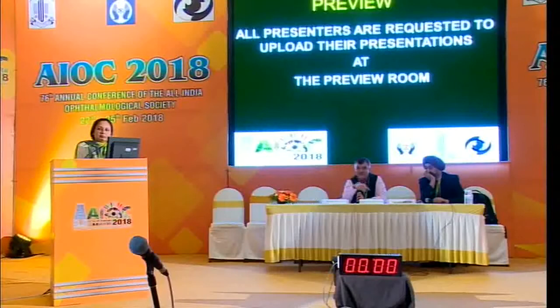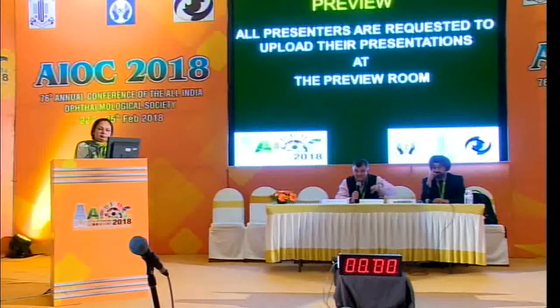So intraoperatively, do we need to relax the retina to make it settle, that stiff retina? Not always. If you have no breaks, don't create additional breaks. It will go back slowly. Some of you who do the surgery routinely must have realized it's not that easy to drain all that stuff. It doesn't flatten that easily. So you need not do that. If you have nicely removed everything, it will definitely go back. Thank you.